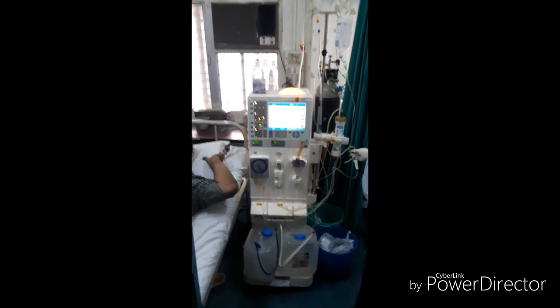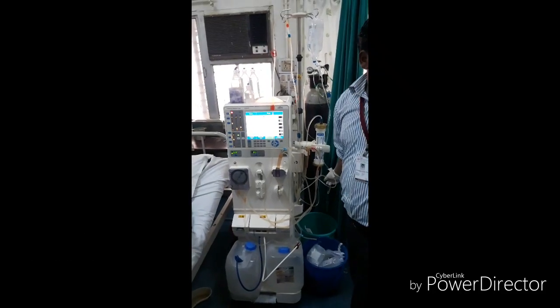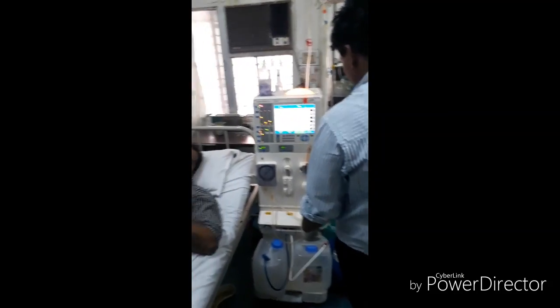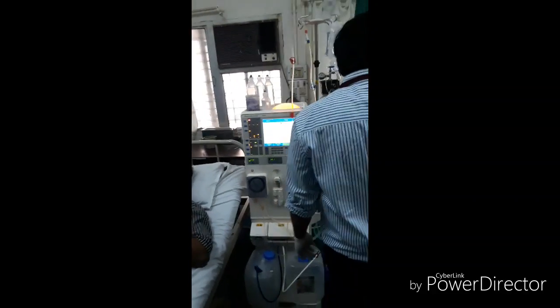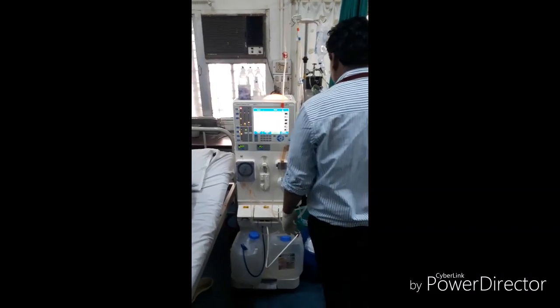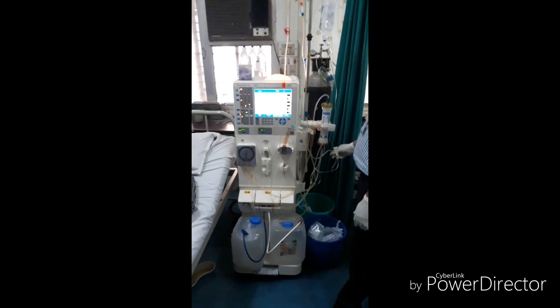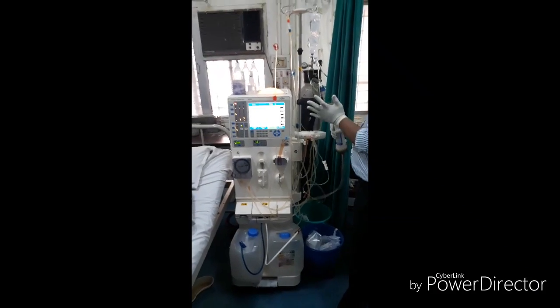The functioning of the dialysis machine is based on the principle of diffusion. As we know, a solution always moves from an area of high concentration to an area of low concentration. This dialysis machine works upon that same principle.